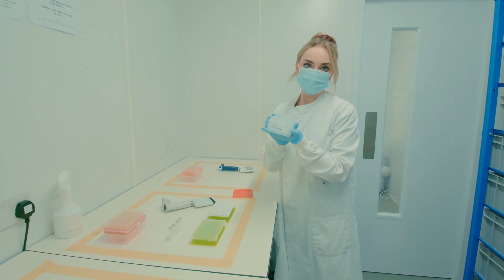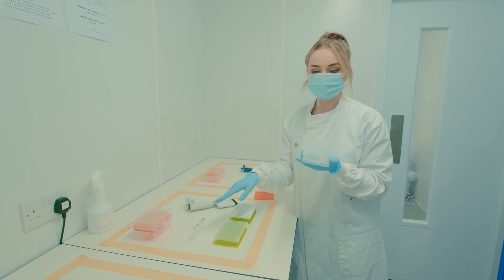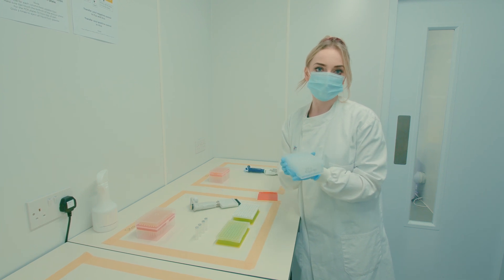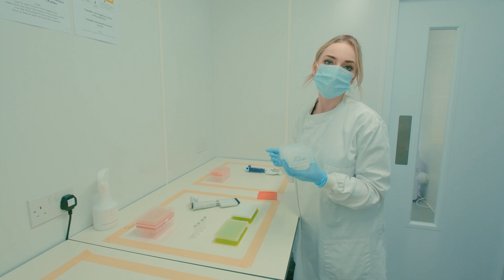In this room we take our purified viral RNA and combine it with a mixture of reagents. These act as the building blocks to allow us to detect the presence or absence of the virus when we go through to the final stage, which is PCR testing.